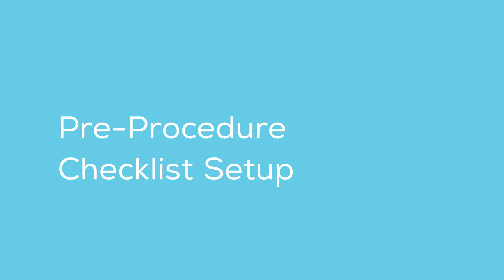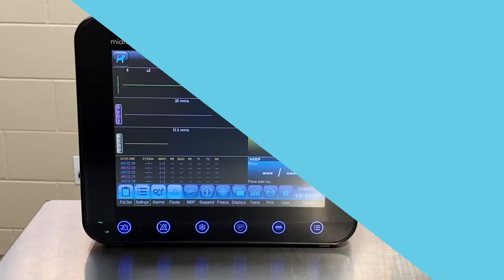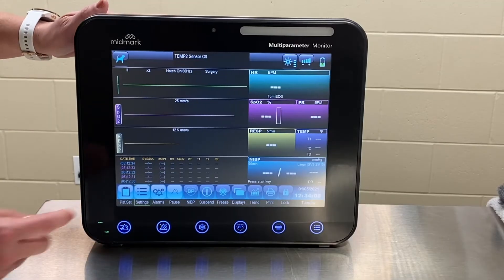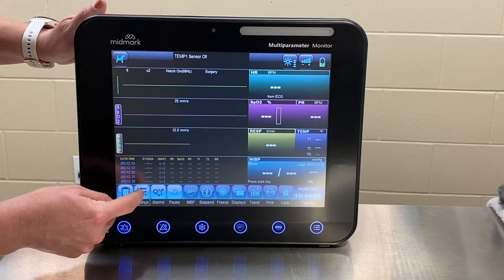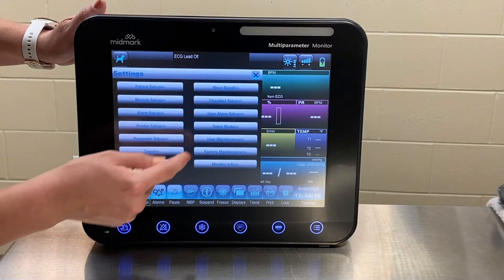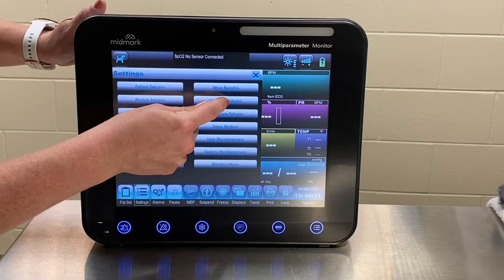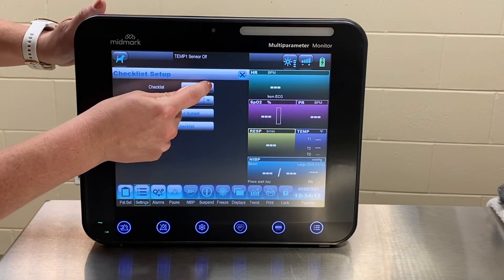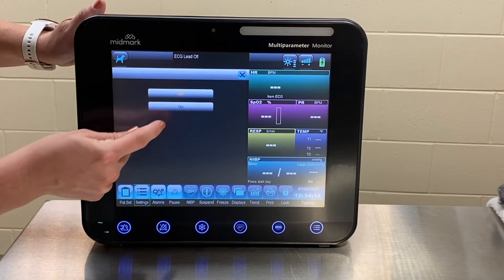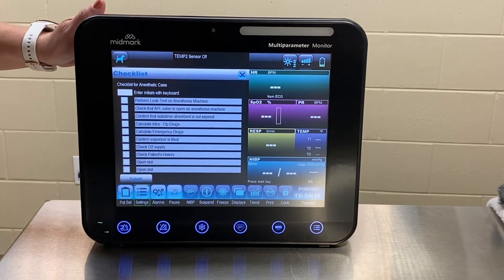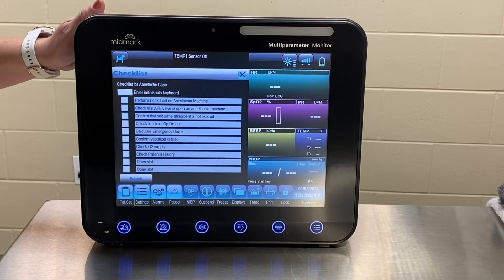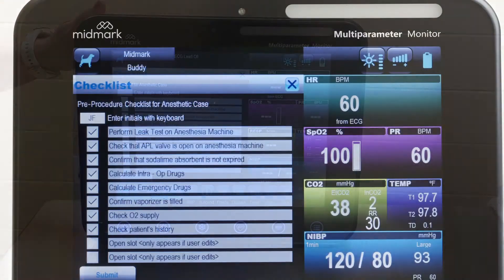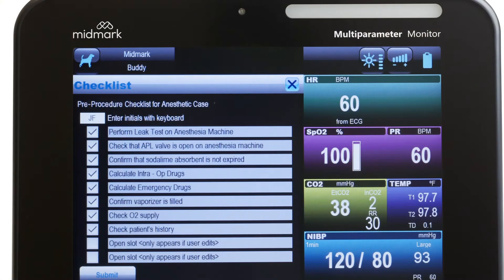To turn on the Pre-Procedure Checklist, press Settings, select Checklist Setup, expand the checklist drop-down, and select On. Every time a new patient is entered, this checklist will display across the screen, prompting the clinician to check off all the steps.